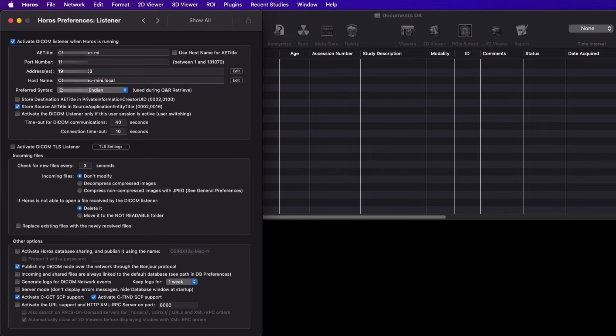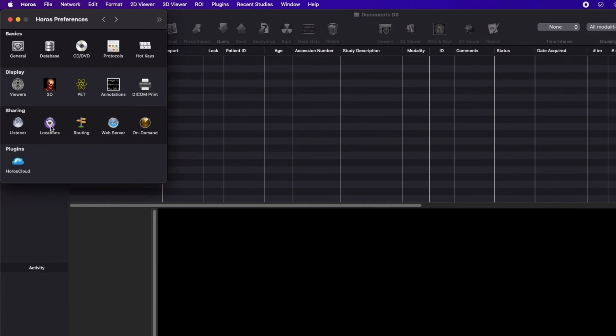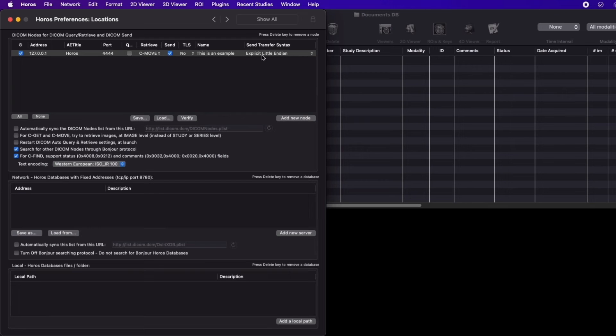Next, in the listener settings, set the AE title and port number for Horos. You also have the option to configure TLS settings for DICOM-based listeners.